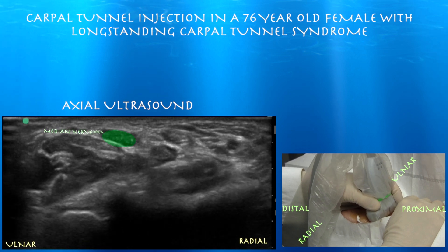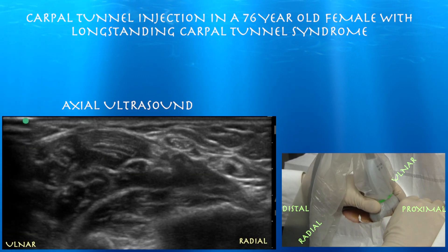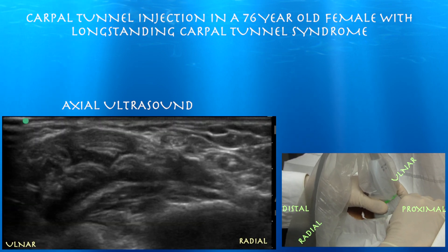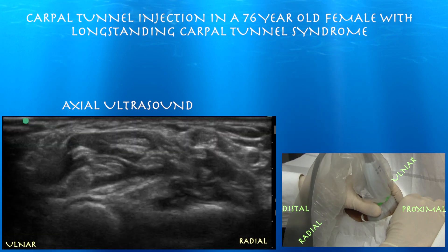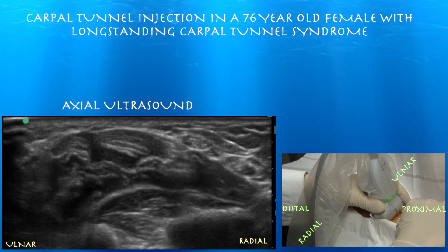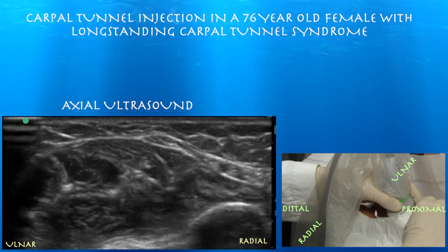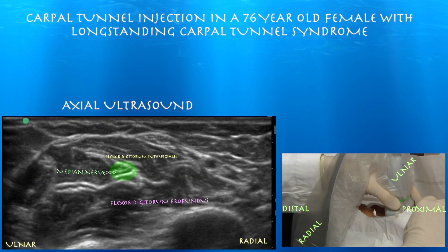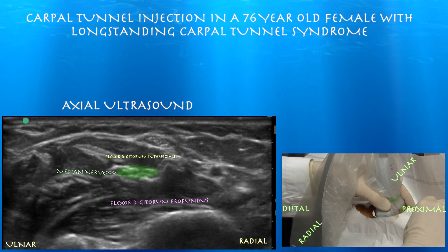Here's our median nerve basically in the wrist crease. Going proximal, you can see how it dives down and starts to migrate between the two flexor muscles. Here it is between the flexor digitorum superficialis and flexor digitorum profundus muscles. This is a really easy way to identify the nerve — just see how it migrates between those two muscle layers. None of the tendons do that.